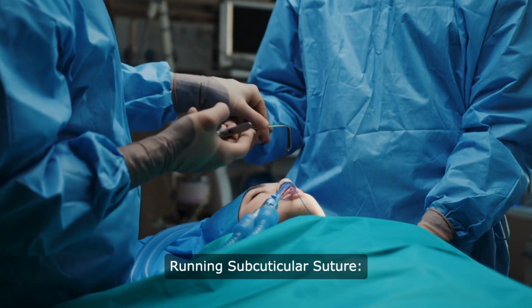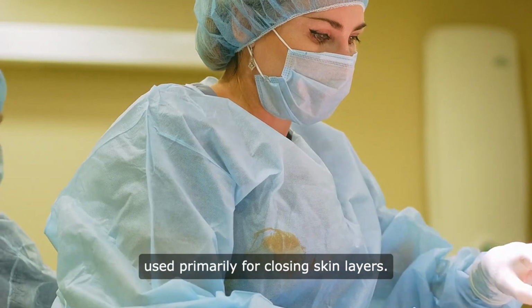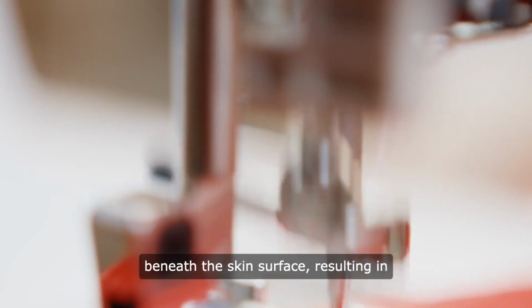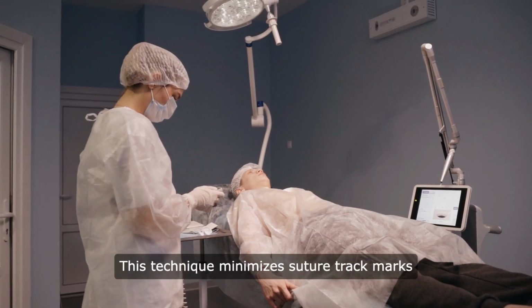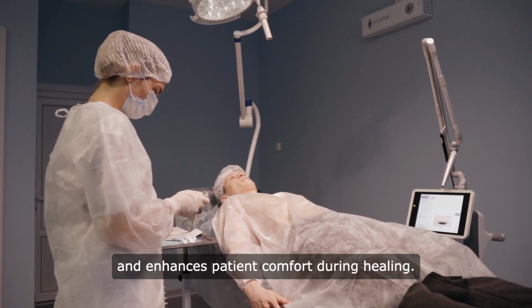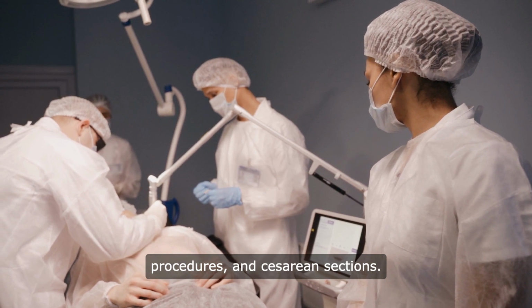3. Running subcuticular suture. A running subcuticular suture is a variation of the continuous suture technique used primarily for closing skin layers. Unlike traditional continuous sutures, the subcuticular suture is placed beneath the skin surface, resulting in a cosmetically appealing wound closure. This technique minimizes suture track marks on the skin, reduces the risk of infection, and enhances patient comfort during healing. Running subcuticular sutures are commonly used in plastic surgery, dermatologic procedures, and cesarean sections.